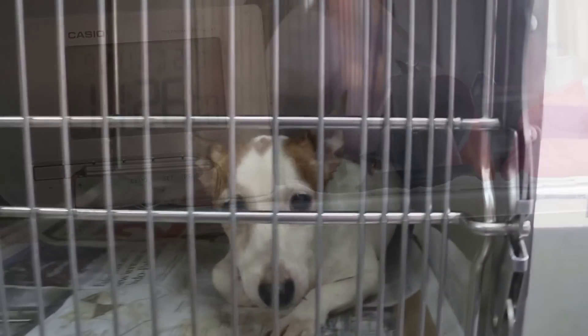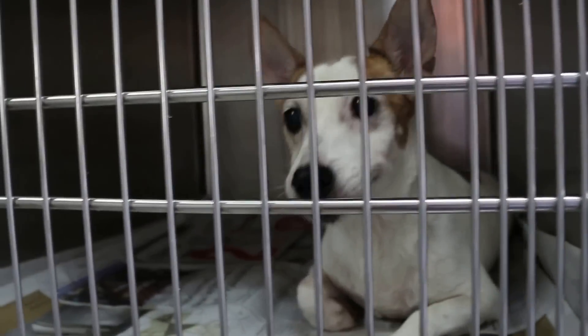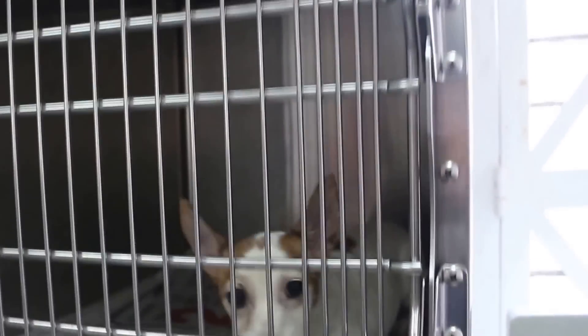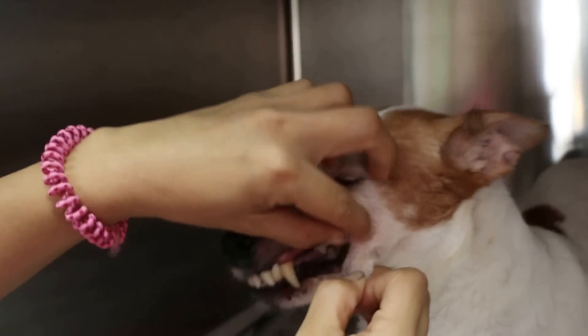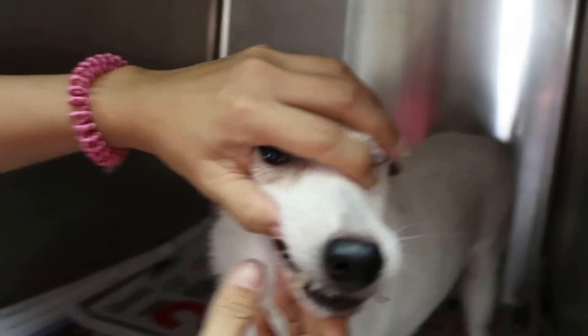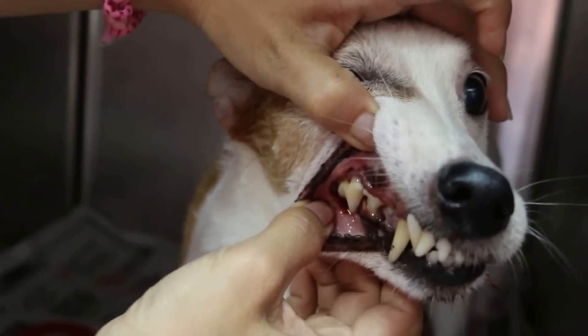The old dog has woken up after the dental scaling. Have a look at his teeth — from dental scaling and extracting of four teeth at the back. Just have a look at his mouth — he won't bite. If they can, they will do the brushing. The four back teeth have been taken out — upper and lower.